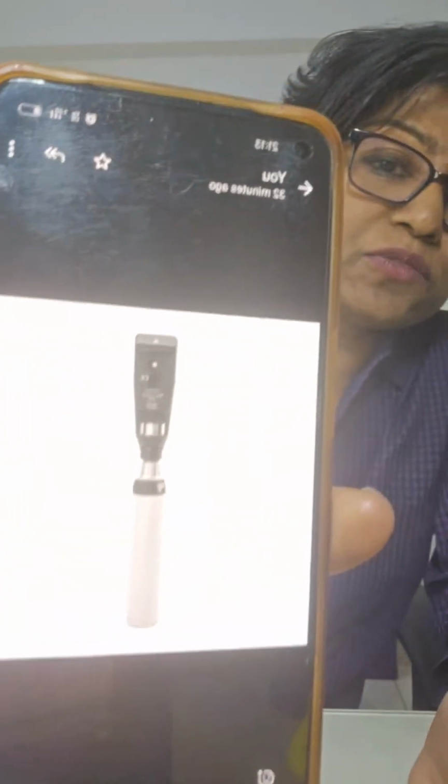And retinoscope, of course, yes, the most objective way to find out astigmatism, and the axis of astigmatism. Yes. So clear on this, all of the following are used in the diagnosis of astigmatism except Bagolini's striated glasses. Now next question, during accommodation, all of the following changes occur except.